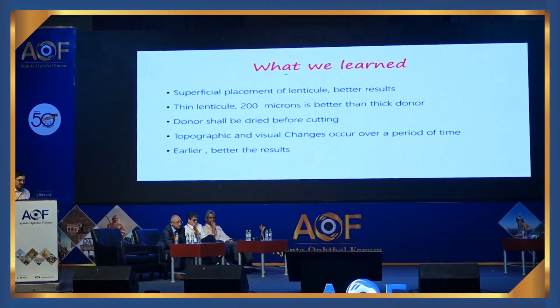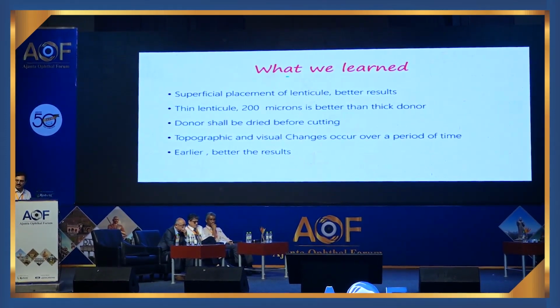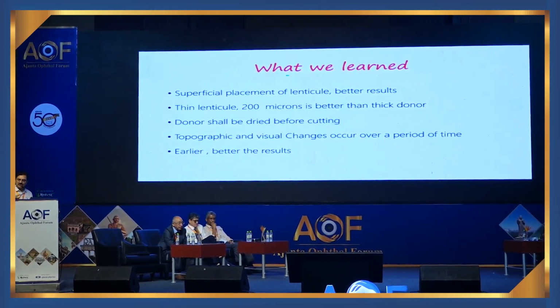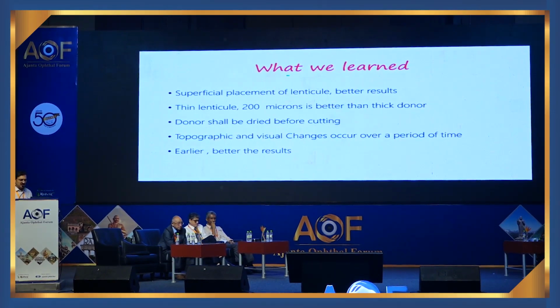And what we learned is the donor cornea should be very well dried in an artificial antechamber. Instead of putting fluid, you put air in the artificial antechamber and leave the cornea for a certain period of time, so that it becomes dry and uniform. And topography results are very good. Visual results also improve. But early cases do better than the advanced cases.